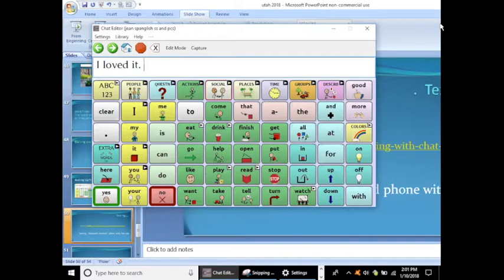And so then there it is. And that's it. When she answers me, I'll get a little notice up here saying that I get a little smiley face coming in.